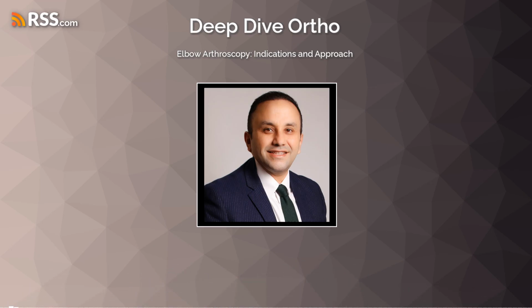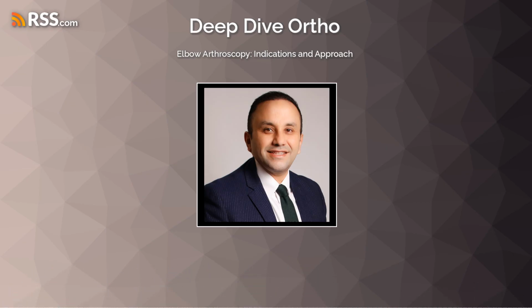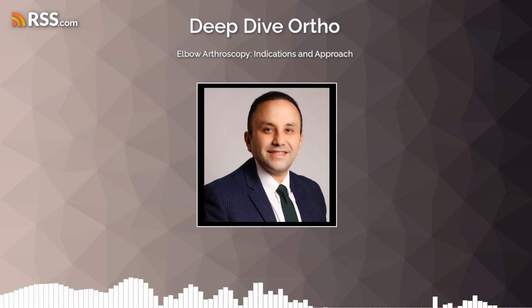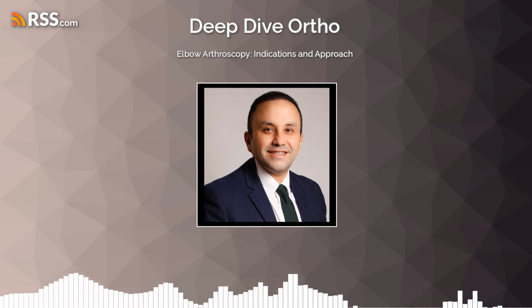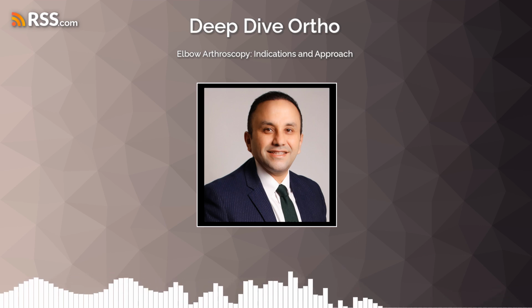Very important. Regarding the ulnar nerve specifics, surgeons must be acutely aware of ulnar nerve hypermobility or subluxation, where the nerve slips out of its groove. This can predispose it to contusion or laceration during anteromedial portal creation. Iatrogenic injury can also occur if portals are created blindly, especially after a prior subcutaneous ulnar nerve transposition, which can alter its expected anatomical course.